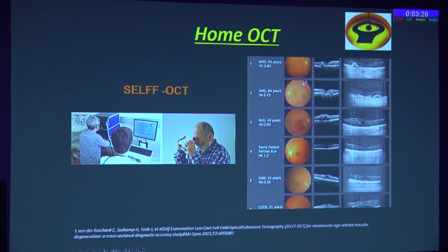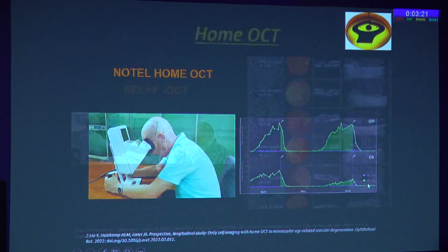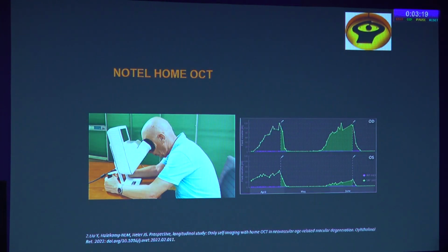If you see in this row, this is the conventional OCT, and these are the OCTs taken by the home OCT. And the Notal home OCT is already available in the market, and they say it costs around $1,000. This has a very short learning curve. The patient can take the OCT by himself, and the results need not be interpreted by the ophthalmologist.